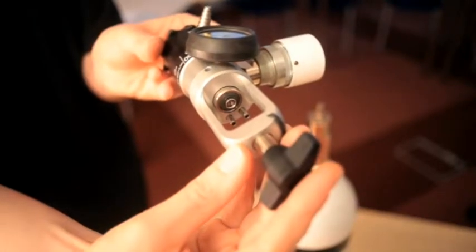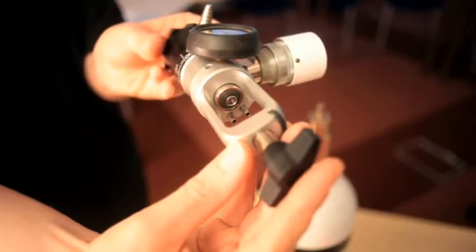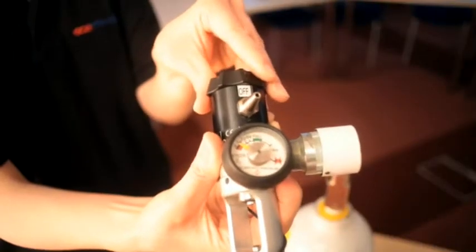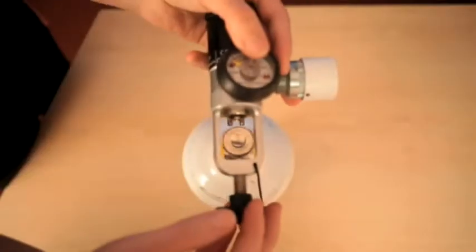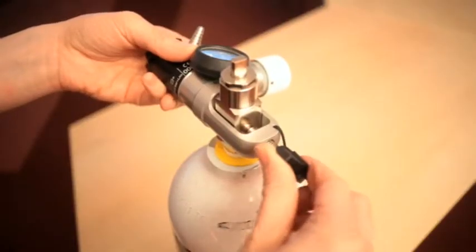Check that the cylinder valve connection and inlet O-ring are clean and in good condition. The flow setting should be set to off. Attach the regulator to the cylinder and tighten the yoke firmly by hand.